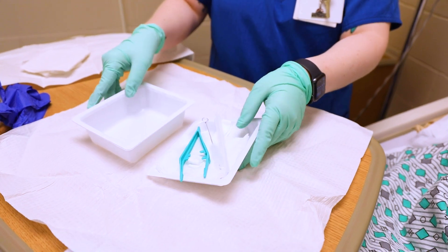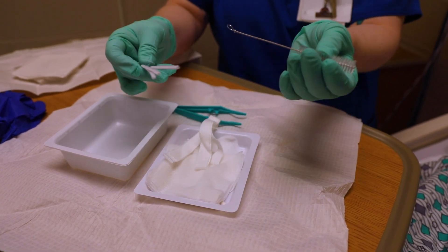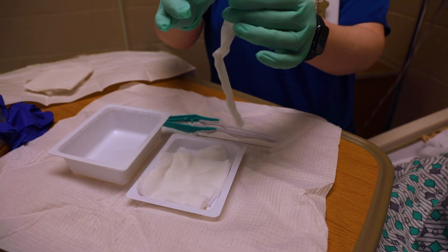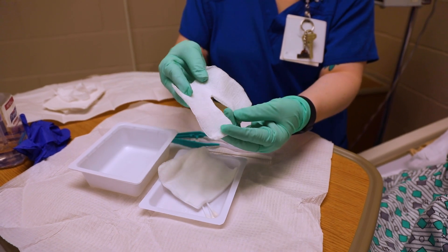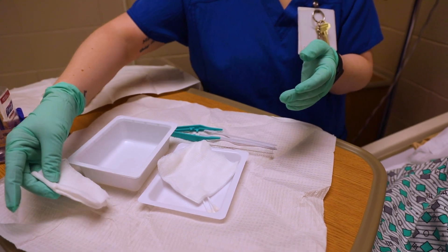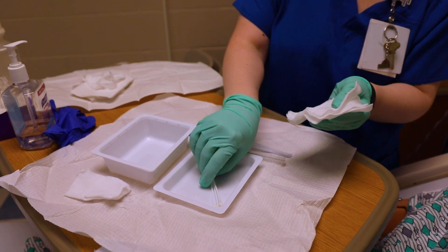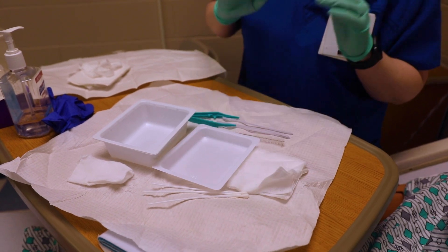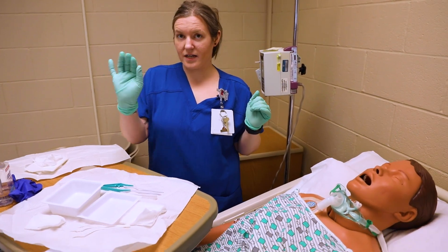There are a couple things in here: a little wire brush that can clean the inside or outside of your trach, and some pipe cleaners. There's a trach dressing that can be used, and a split dressing to help ensure secretions from the trach don't get on the patient. There's also gauze to clean, and some items to help clean the patient's skin. I'll set this stuff off to the side.